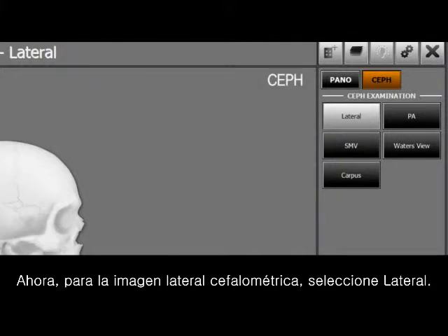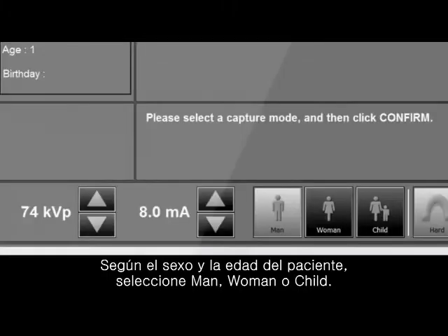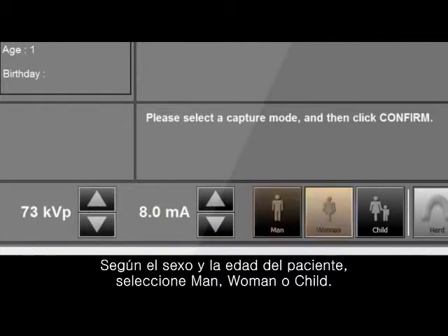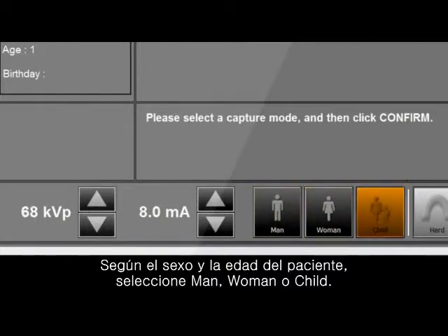For the cephalometric lateral image, please select the lateral. According to the patient's gender and age, select man, woman, or child.